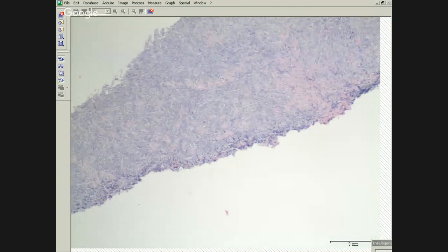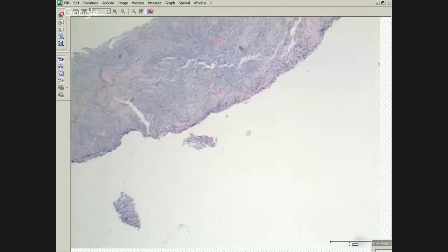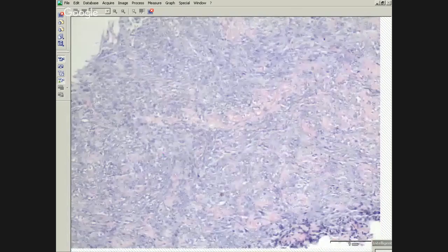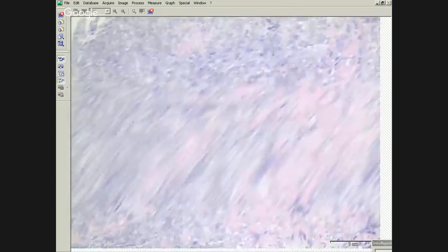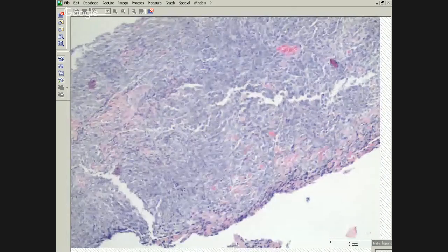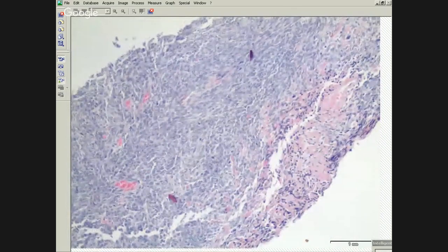Okay, same story, a little bit younger guy, and I apologize that this slide is not the best. I'm showing this to point out an important pitfall. So that tells you it's not mesothelioma right away. It's cellular still, but cells look bland. And they all look pretty similar.